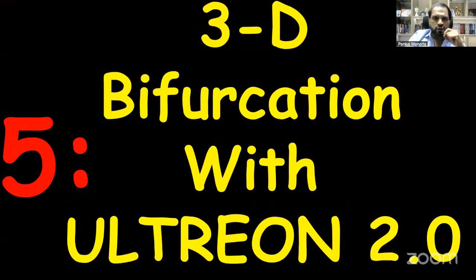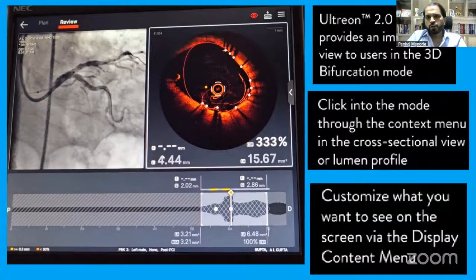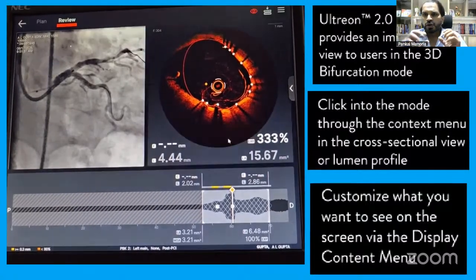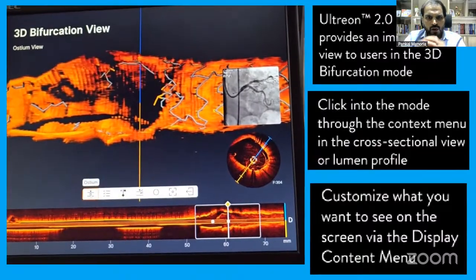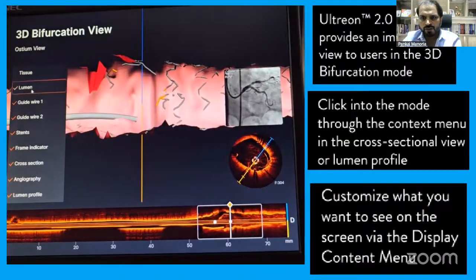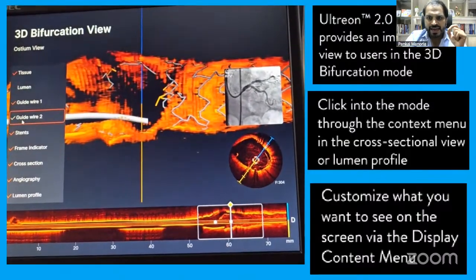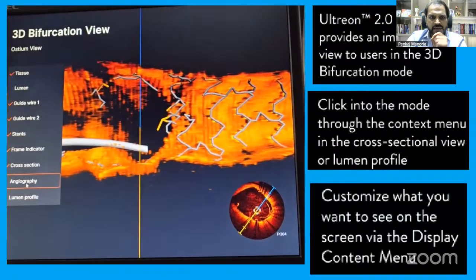Another feature which is very useful is 3D bifurcation with Ultreon 2.0. This has improved much as compared to Ultreon 1.0. In 3D bifurcation, it provides an immersive view to see the bifurcation. What you have to do is click into the mode through the context menu in the cross-sectional view or the lumen profile, and then you can customize what you want to see on the screen by the display content menu.